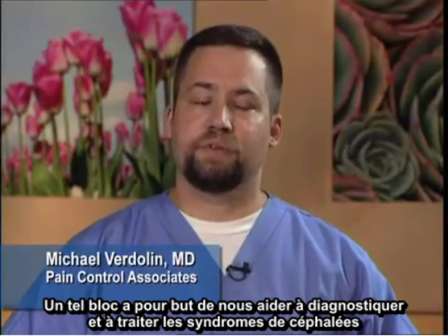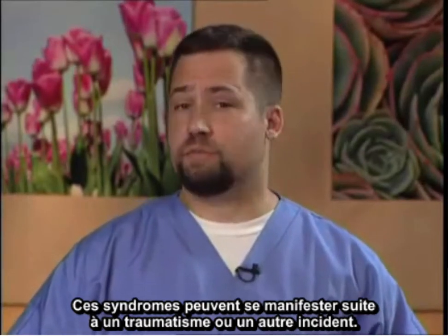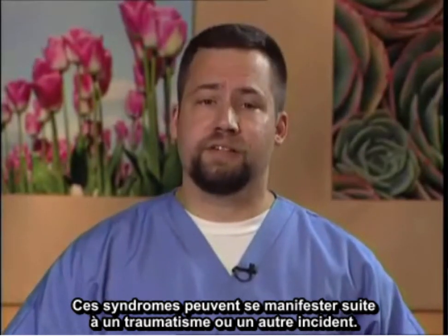Today I'm going to demonstrate a greater occipital nerve block performed under ultrasound guidance. The purpose of this block is to help diagnose and treat headache syndromes that may be arising from the posterior occiput. This can occur as a result of trauma or other incident.